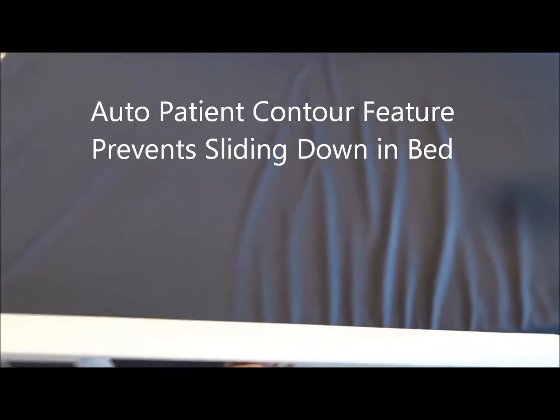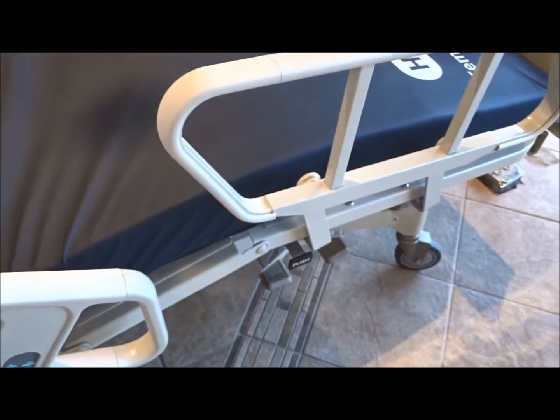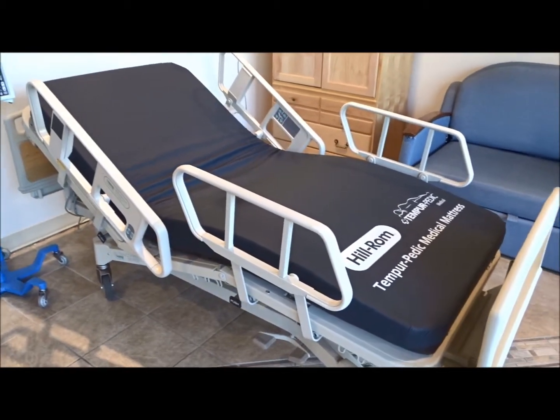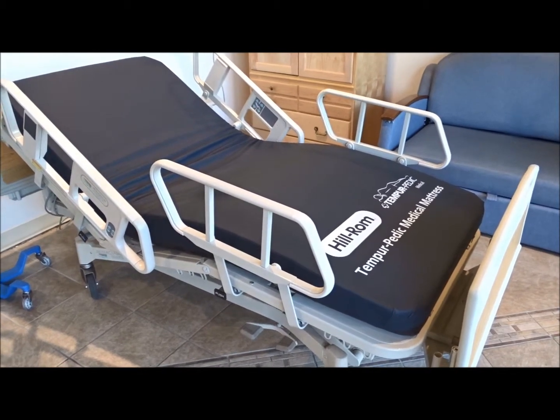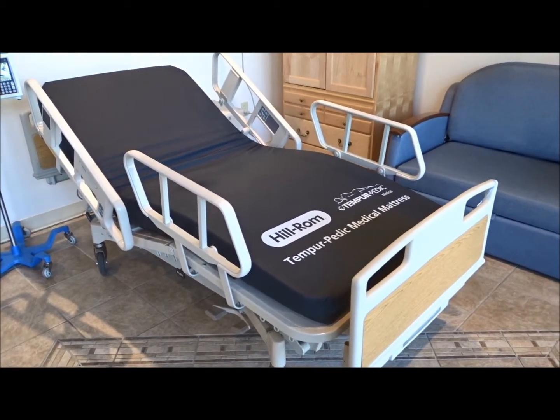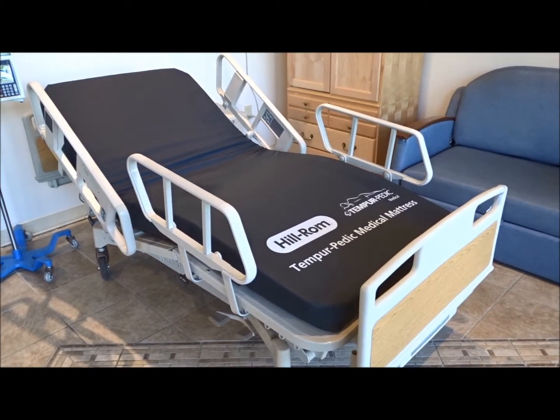One thing the Hillrom Advanced Bed also has is what's called Auto Contour. As I lift the head up, you'll notice that the leg section is also bending just a little bit. Auto Contour puts a slight bend in the leg area so when the head goes up, that bend in the leg keeps the person from sliding down to the bottom of the bed. You can see that function right here — as we raise the head of the bed, the leg section goes up along with it to keep the person stable.